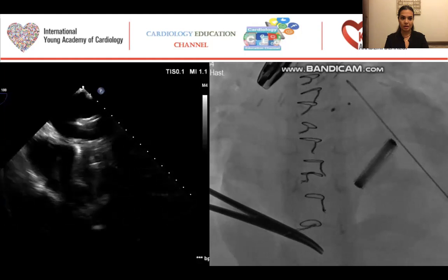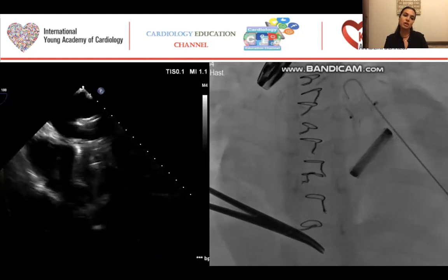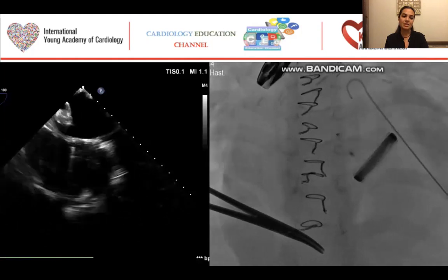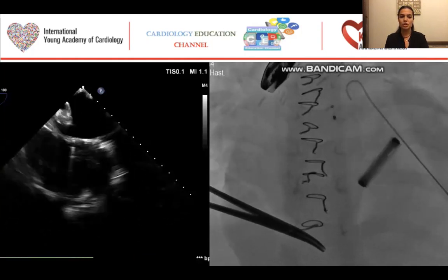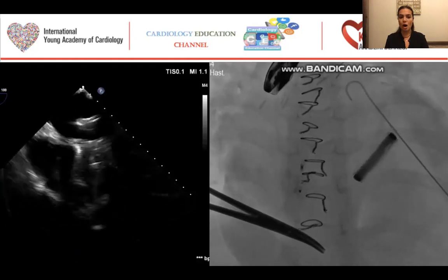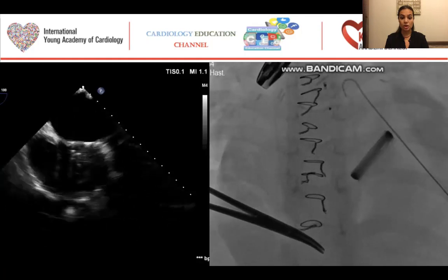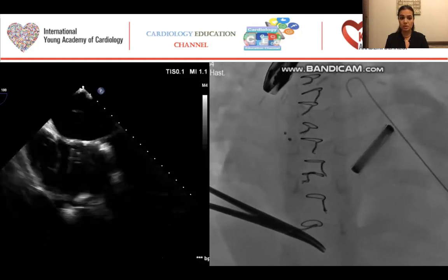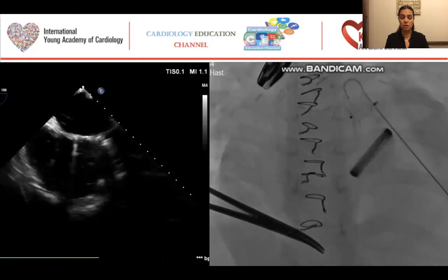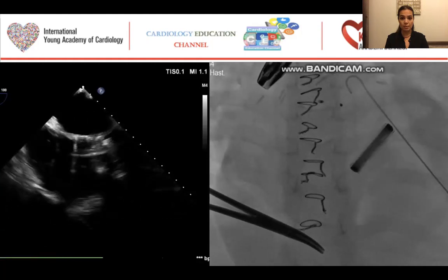This is a nightmare. This patient is a 9-year-old, I think, and she was admitted to our pediatric cardiology clinic. She had a history of 2 mitral valve replacements, and now she suffered from heart failure and hemolytic anemia.